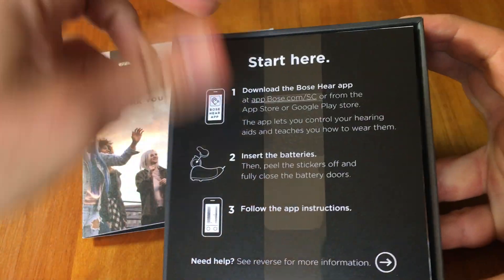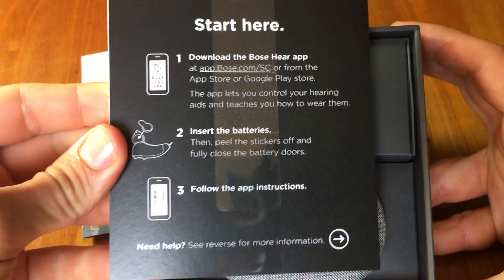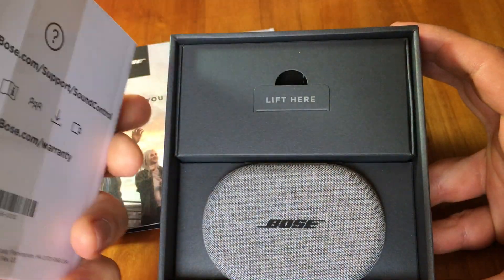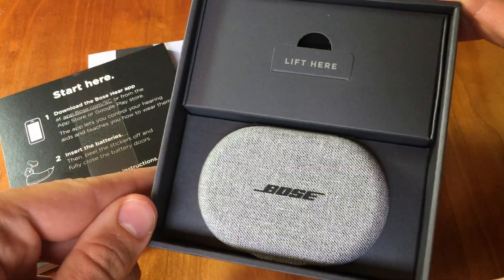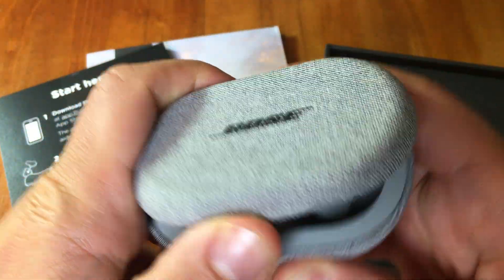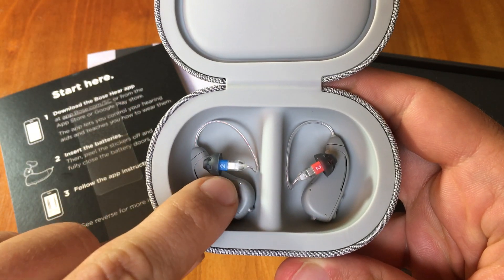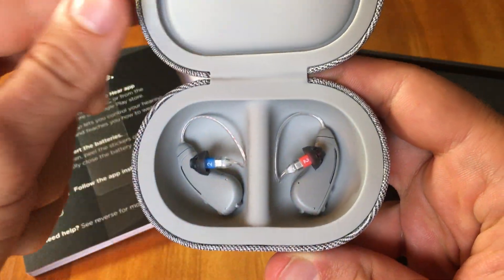It has a menu and some instructions about how to start by downloading the Bose app, inserting the batteries, and then opening up the smartphone app to follow the instructions. You can see here is a nice gray case. Let's open that up. Here we have the hearing aids — this blue color is for the left ear, and this red color is for the right ear.